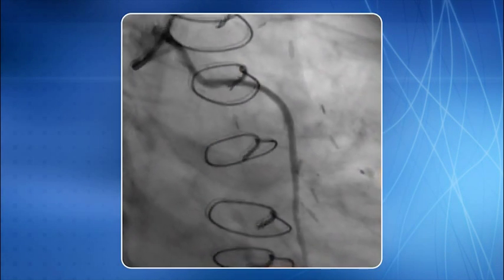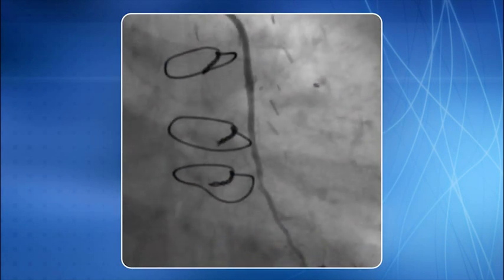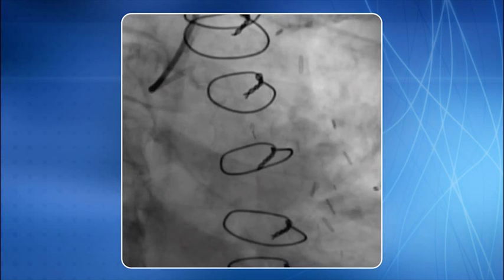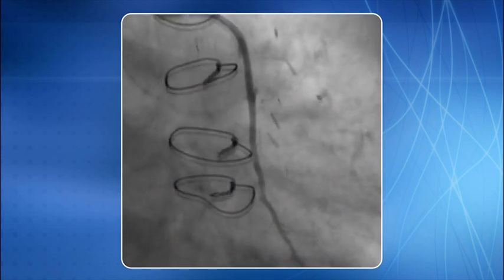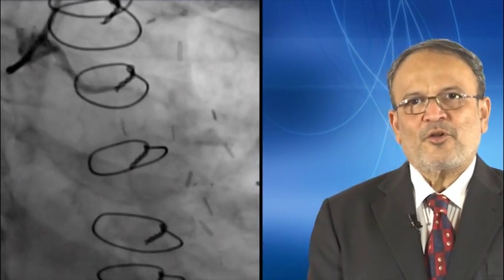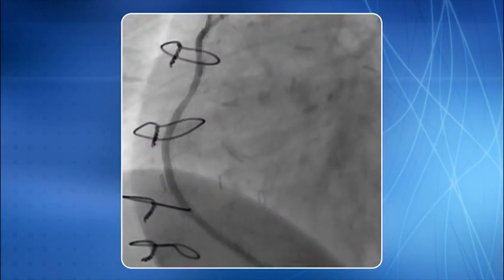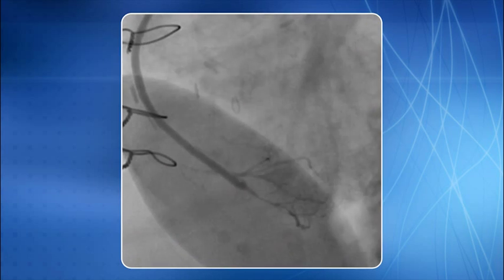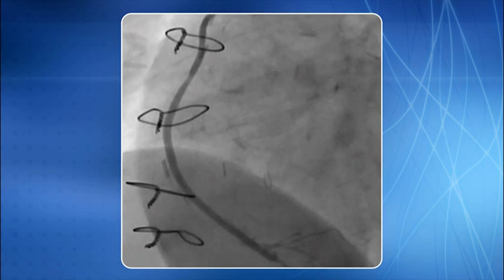Here is an example of a patient whose saphenous vein graft to OM branch was cannulated using the 5F opti-torque TIG catheter. Many times with the use of a single diagnostic catheter — the 5F opti-torque TIG catheter — we are able to complete not only the diagnostic angiogram of native arteries, but also all bypass grafts including SVGs, radials, as well as left and right internal mammary artery grafts. In this particular case, the catheter was used to cannulate the saphenous vein graft to PDA.